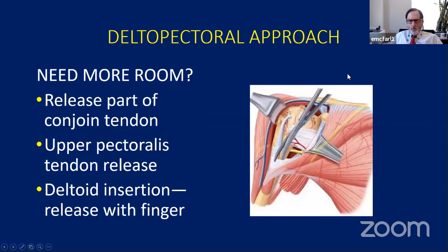If you need more room and you're having any trouble seeing, it doesn't really hurt to release some of the upper portion of the pectoralis insertion. You just have to be careful because where it inserts, the biceps tendon is right underneath of it. So I usually tenodese the biceps tendon as opposed to a tenotomy. If you were to get the biceps tendon down here, it's not the end of the world. You can just do a tenotomy, but I try to take it and protect it.